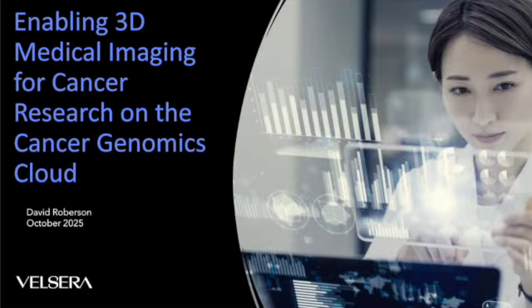I'm Dave, and today I'm really excited to be here to speak to you about how we're enabling 3D medical imaging for cancer research on the Cancer Genomics Cloud. Over the next several minutes, I'll explore the powerful new capability that brings advanced imaging analysis directly into your research workflows.